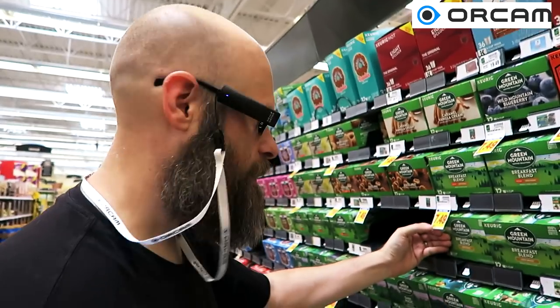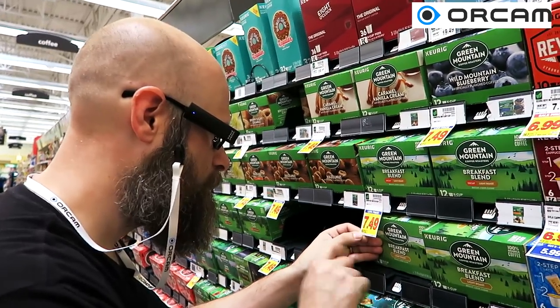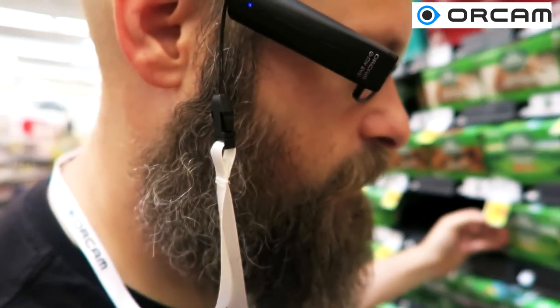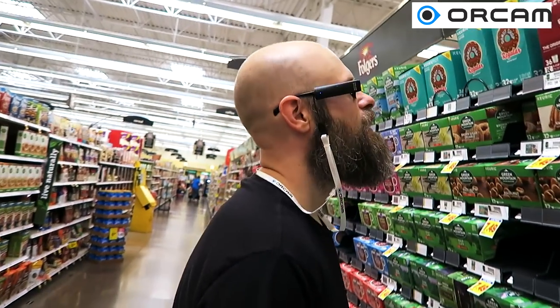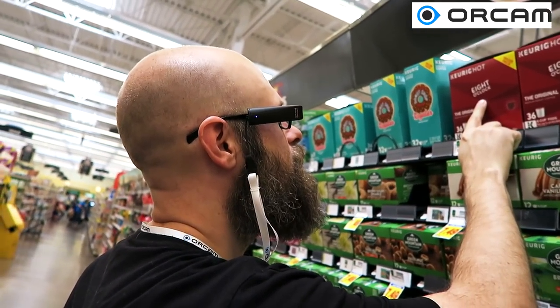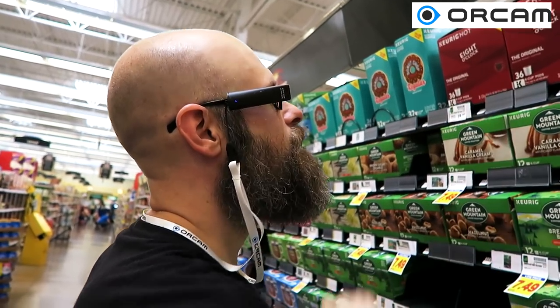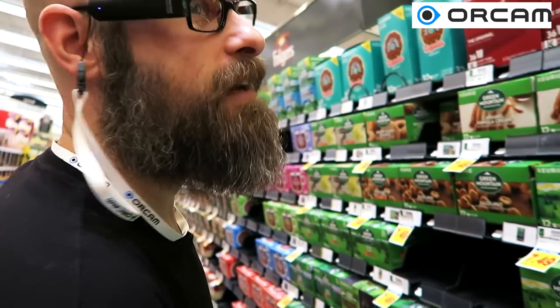It didn't read anything. Let's get closer. Nope, didn't say anything — it might be too much information. Let's try something else. It said it can't read text. How about we'll just try to take a picture.